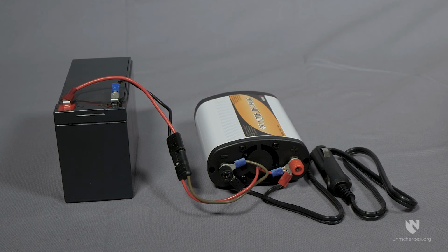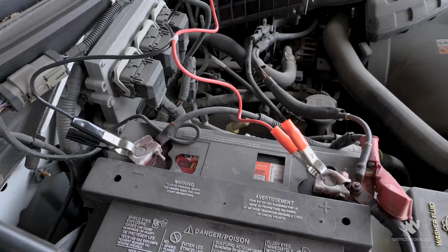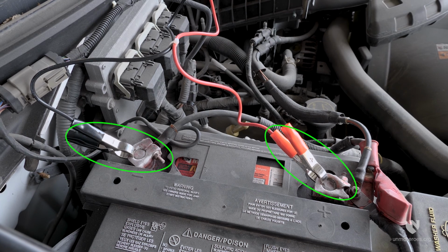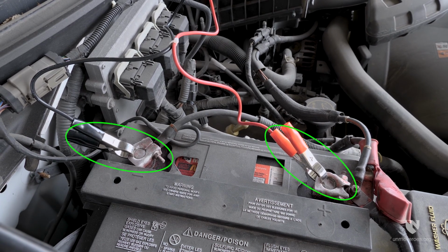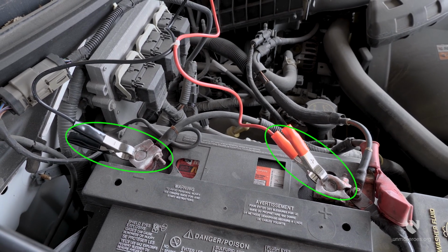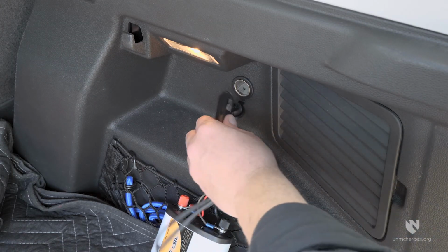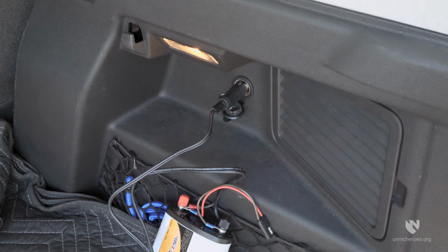If using the supplied battery, you would connect the inverter directly to the battery using the 2-way flat connectors. The inverter can also be attached directly to an automotive 12-volt battery using the supplied set of battery cables with clamps. Finally, the inverter can be used via a vehicle's 12-volt power outlet.